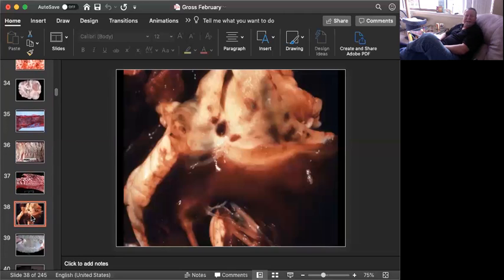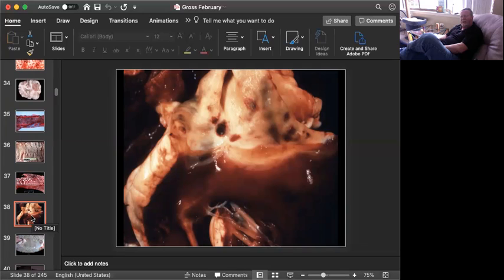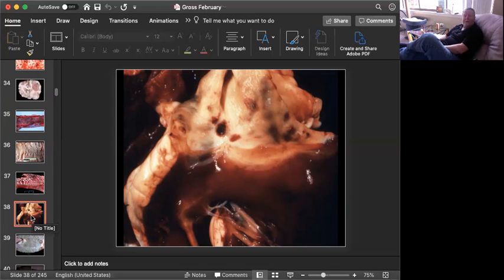This is slide number seven, and it is tissue from a sheep. Can you give me a morphologic diagnosis and a cause? Okay, time's up. This is a classic lesion.